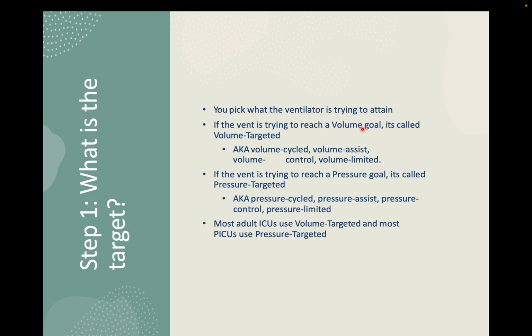So if you have volume goals, let's say you want to deliver a set tidal volume, a tidal volume of 400 ml, definitely use volume control. In it, the tidal volume you want is already set, like 380 ml or 400 ml. So no matter what amount of pressure is required to deliver the tidal volume, it will be delivered. So in volume control, you set a tidal volume which will be delivered.